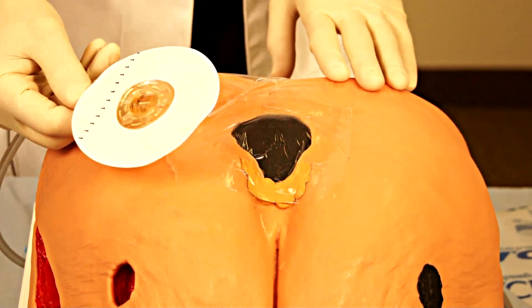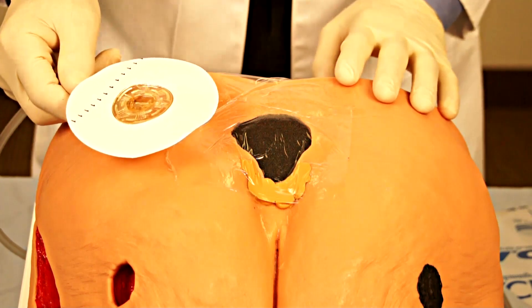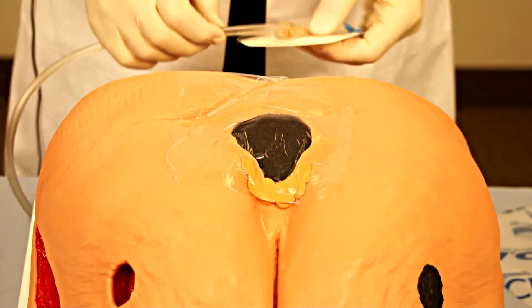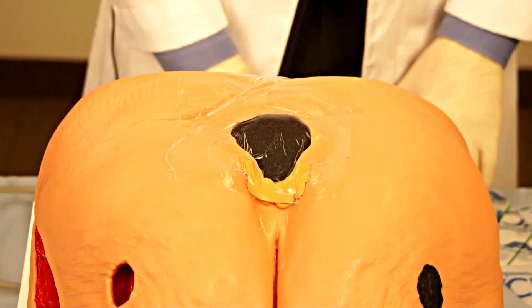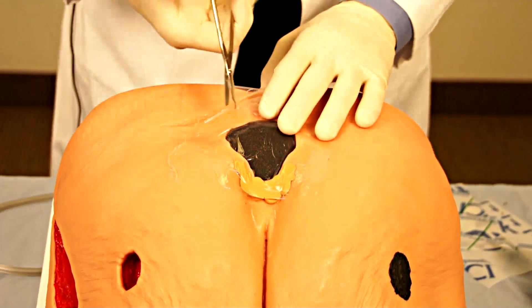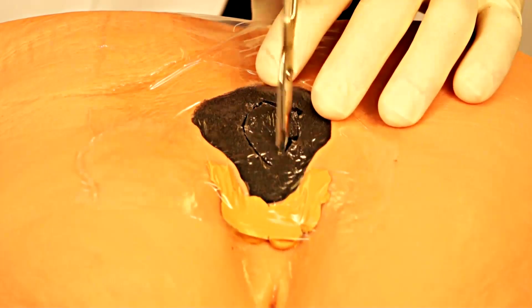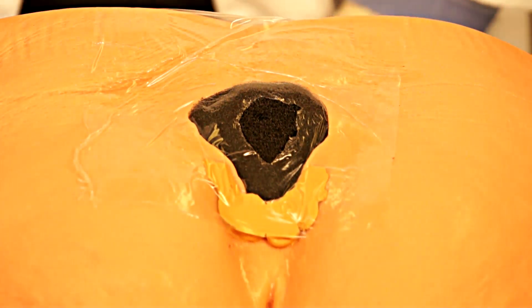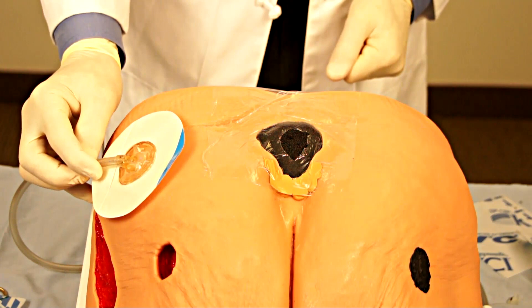There are several options for constructing a bridge. Some negative pressure devices actually have pre-constructed bridging tubing — one example of that is demonstrated here. If you prefer to construct a bridge without using a pre-made device, that is relatively easily done. The first step is to place your sponge dressing or other dressing into the wound, then take away a portion of the adhesive and select a site away from pressure where you would like the tubing to sit. In this case, we are going to bring it off to the side as illustrated here.